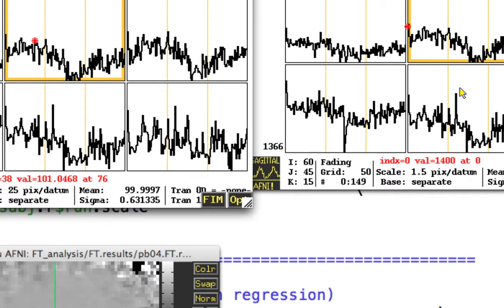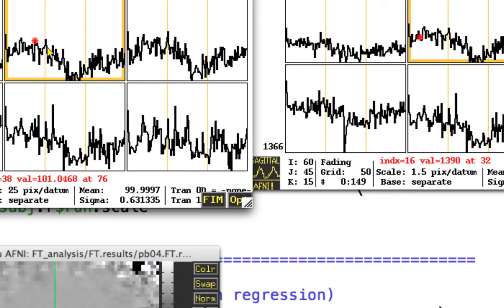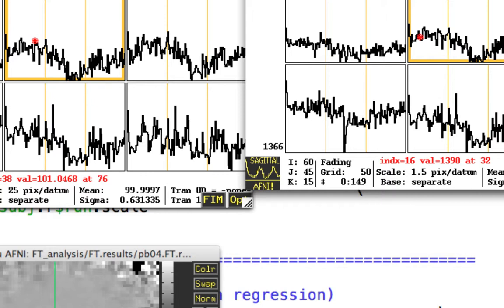Over here, these are the arbitrary signal units in the thousands. So all we've done here is we've scaled it so that anybody else who has arbitrary signal units around, say, 900 or 1,700 or something vastly different from this person, we can put it all on the same scale. That's the idea behind it, and don't worry if this scaled image looks extremely uniform and kind of noisy. It's just because everything is now essentially almost the same. There's very little deviation.